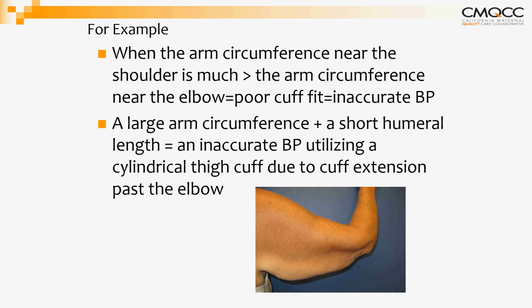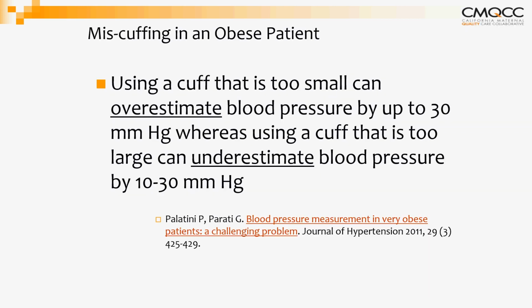Particularly a lot of the disposable blood pressure cuffs that we have are more square as opposed to cylindrical, and that is probably not going to be the best bet for a patient with a large arm circumference. So you may have to use a thigh one, but if you go to the next slide, that might explain a little bit more.